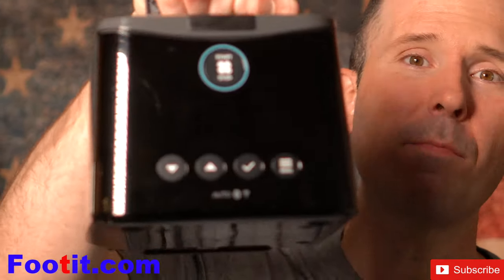Hey, what's going on CPAP Nation? So last night I tried out the Fisher and Paquel Sleep Style CPAP machine for the first time. I loved it — one of the best machines I've ever used. I'm going to tell you why, tell you what I love about this machine, and whether or not it may be the right choice for you. Stay tuned because we're getting right into the review.